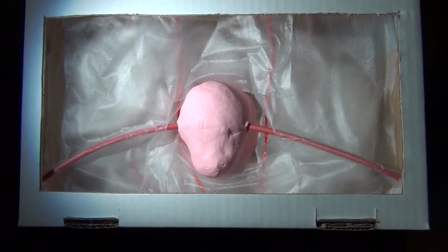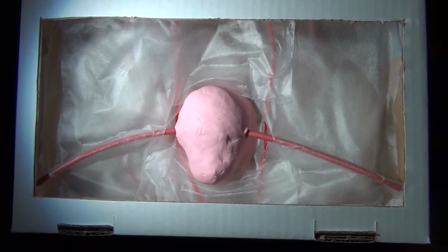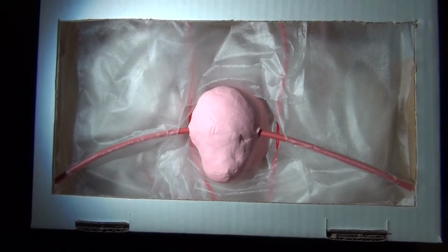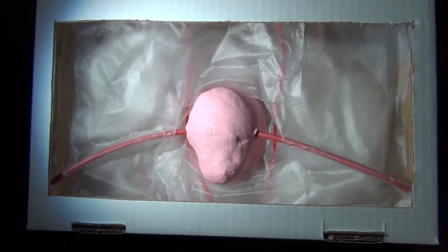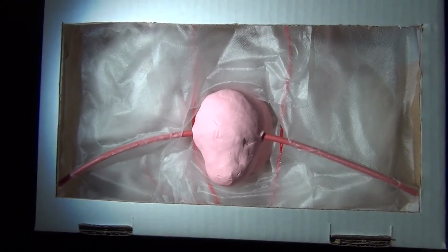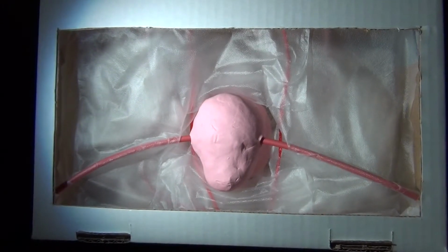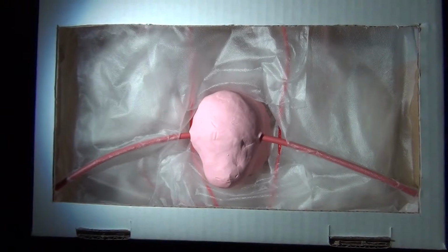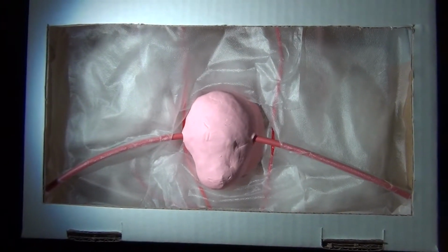This is an important dissection to be performed in complex laparotomies, including distorted anatomy such as with large fibroid uteruses, also in scarred pelvises related to prior surgery or endometriosis scarring, where it is very difficult to identify the ureter. Additionally, in ovarian remnant syndrome, when we're dissecting out the ovarian remnant, and also for large pelvic masses, this is a very important tool to know how to do a retroperitoneal dissection.